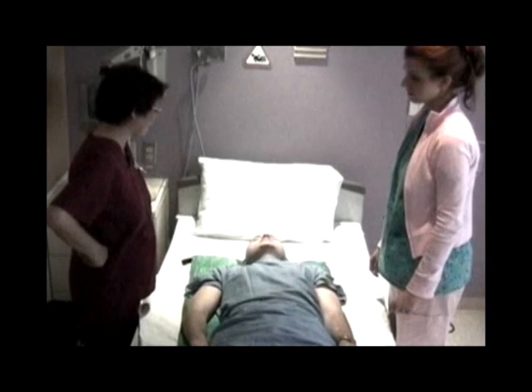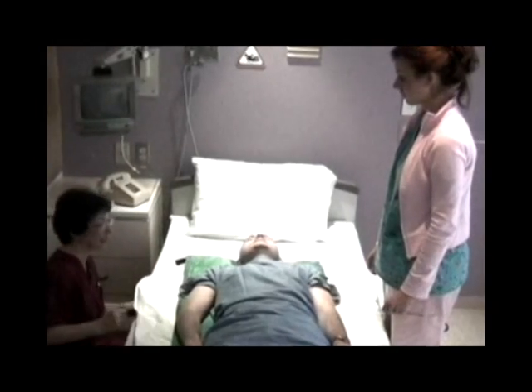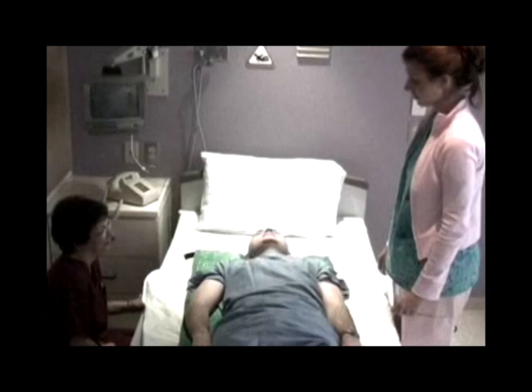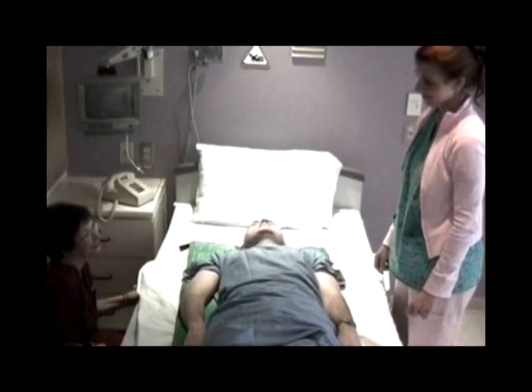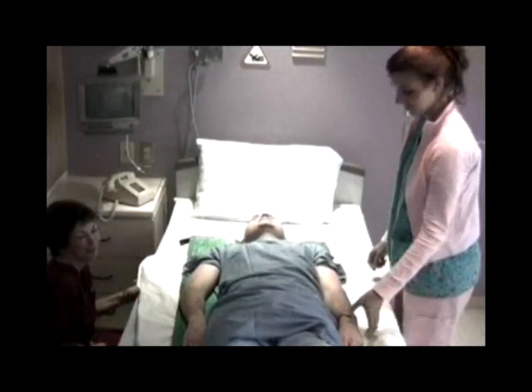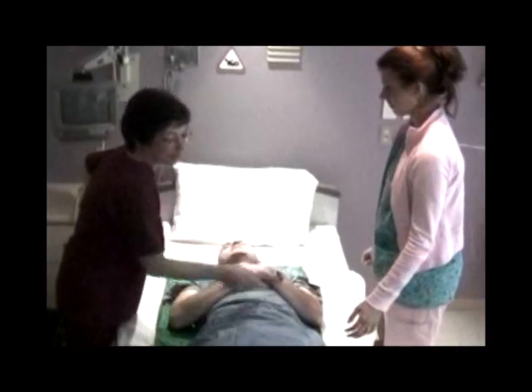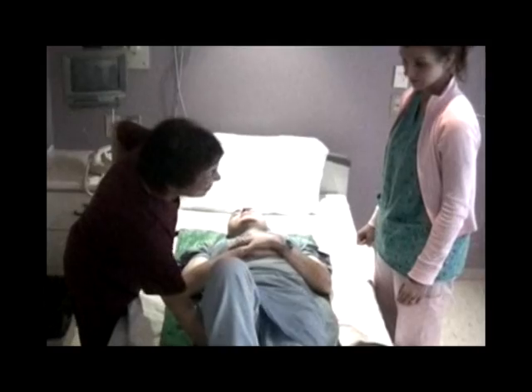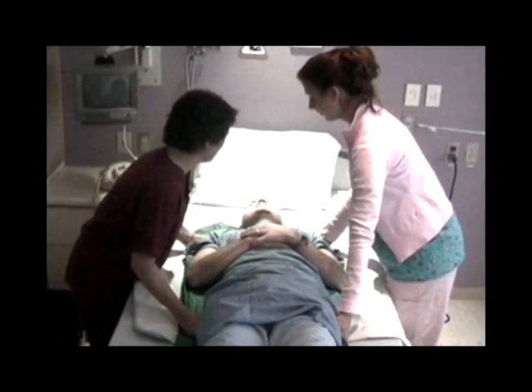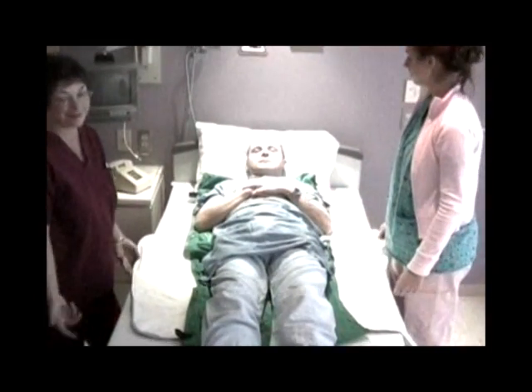Procedure for repositioning a patient up in bed using a slide sheet. Adjust the height of the bed for the caregiver to a comfortable working level, around mid-thigh height. Place the slide draw sheet under the patient for repositioning in bed. Place the pillow against the head of the bed. Ask the patient to bend their knees and to cross their arms on their chest. At the count of 3, both caregivers, using good body postures, grab the slide sheets and transfer the patient to the desired level in the bed.